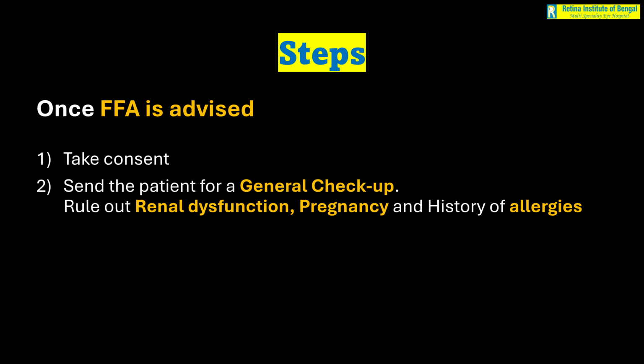Therefore, we need the patient to be seen by a physician, and we need to rule out these histories of allergy before we proceed to do the fundus fluorescein angiography. Now, some places we also do a so-called skin test. That is, we inject a small amount of the dye subcutaneously to look for a possible sensitivity to the dye before we proceed with the test.